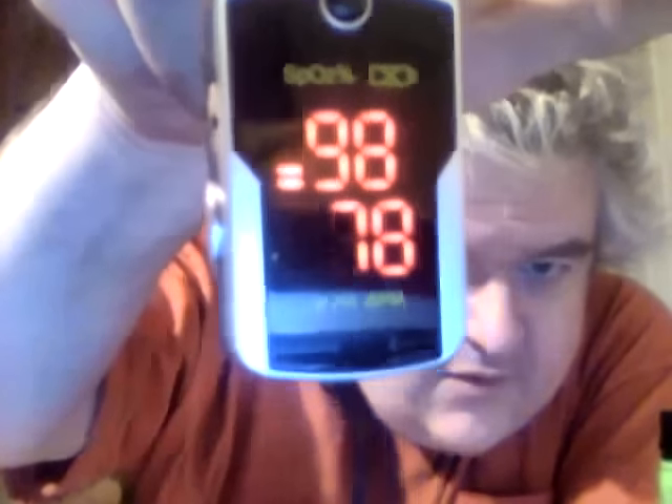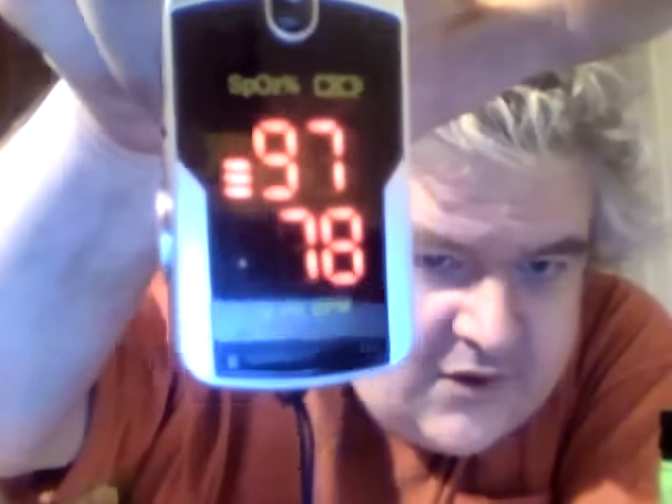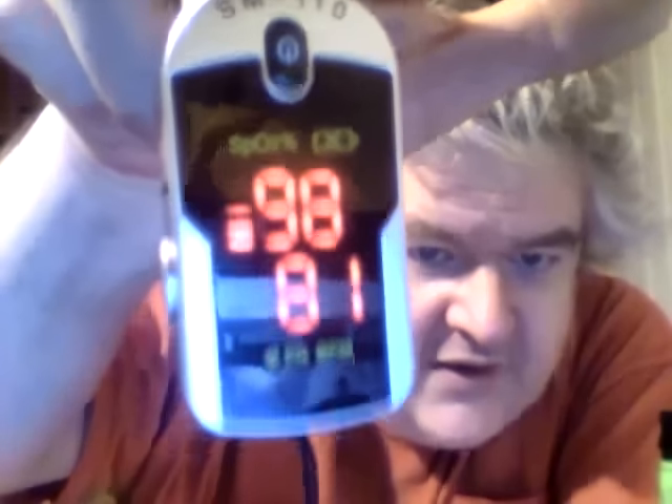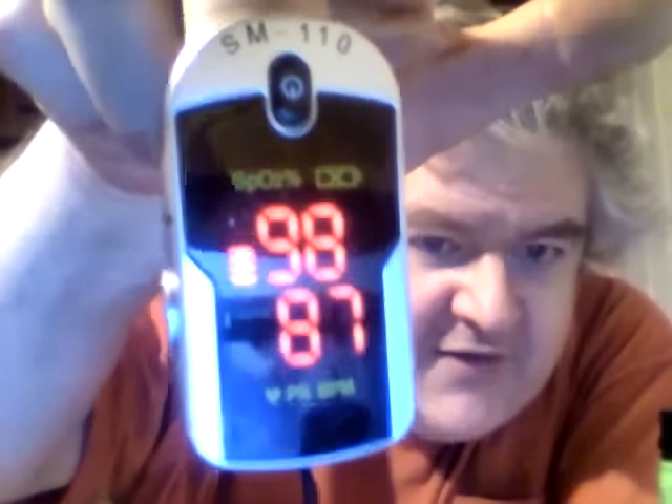Okay, here we go. The oxygen is 97 and the pulse is 78, 79, 98, 81, 83, 85 — see, it's going up because I'm doing the review and I drank a little bit of this beer, which I'm going to be reviewing next. There you have it.